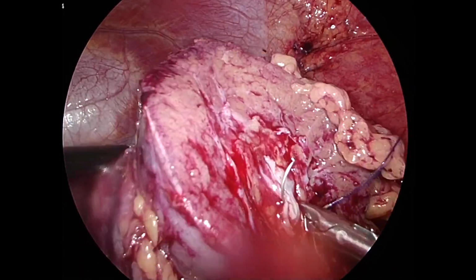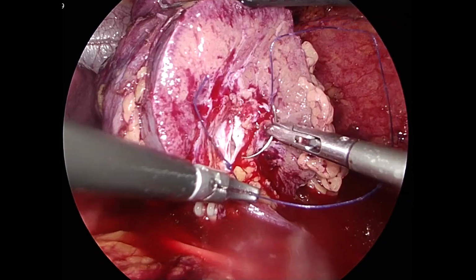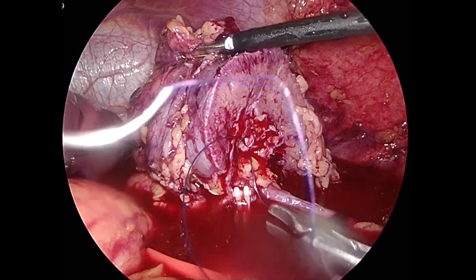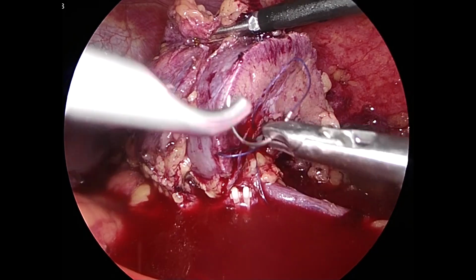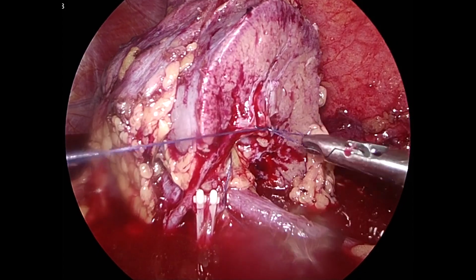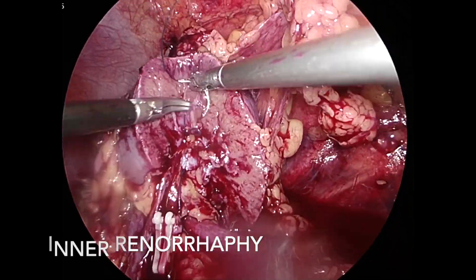PCS closure was done using a Vicryl 4-0 in a continuous manner. Inner renorrhaphy was done using a V-Loc 3-0 suture.